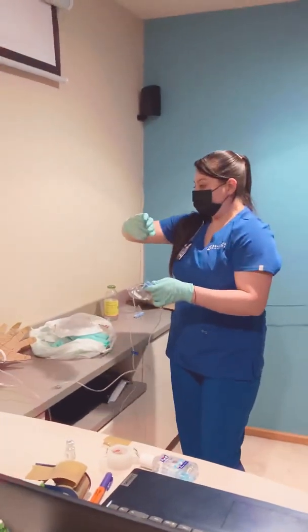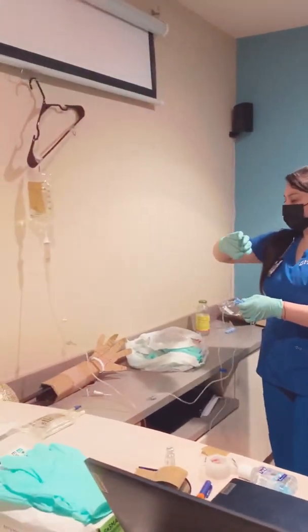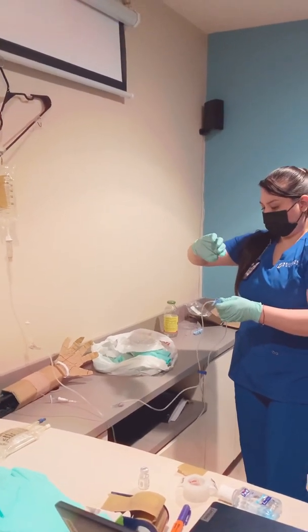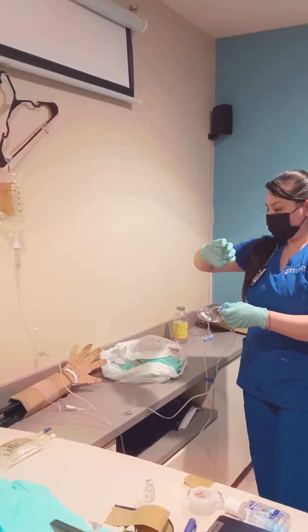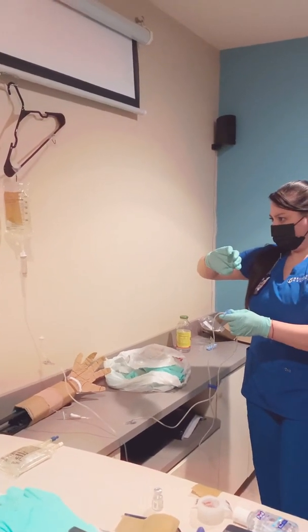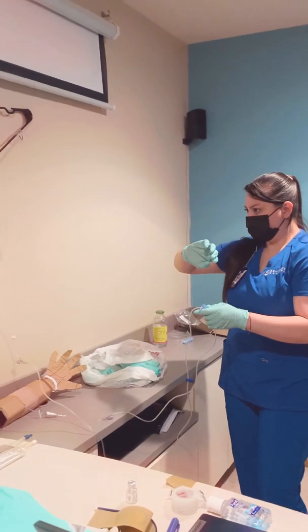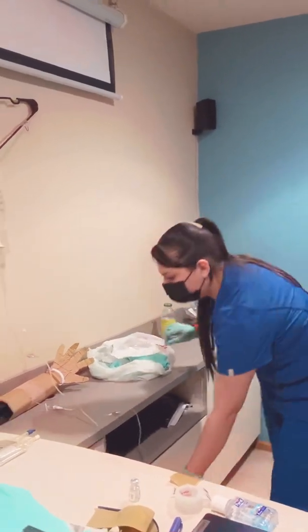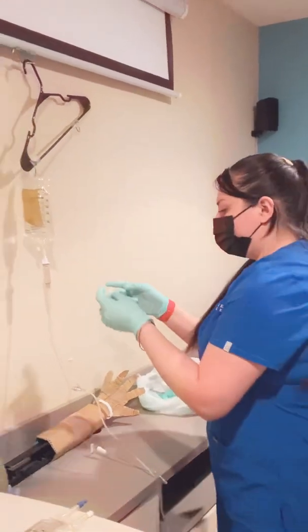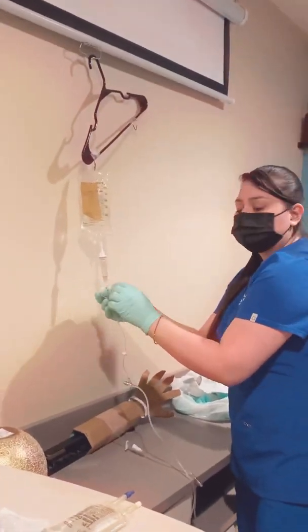So I'm going to do 5 drops per 15 seconds. Okay, looks good. And I'm then going to label my tubing with the time, the date, and my initials.